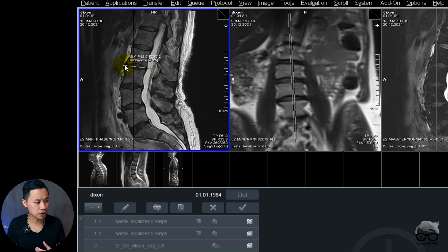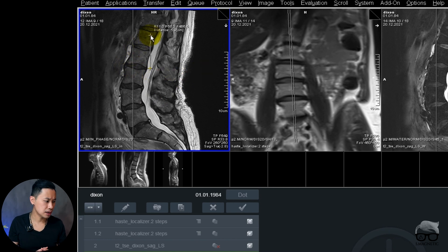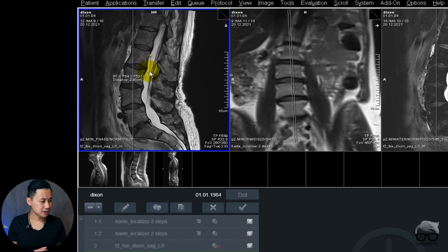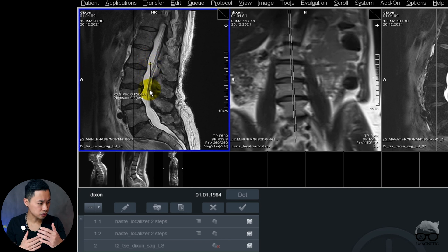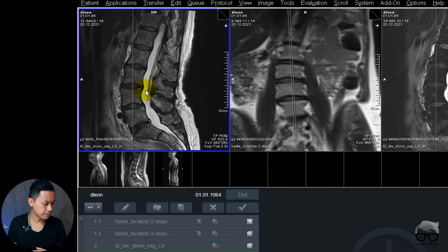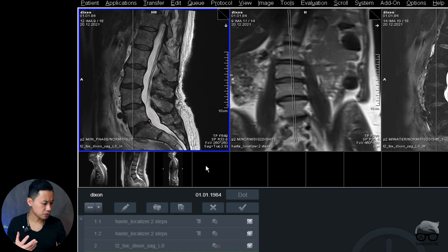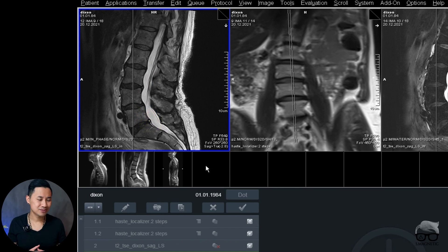I don't need to go into the viewing mode and do this. Awesome, right? It's a cool option whenever you need to measure. I can measure whatever I want. I hope you will find this useful.